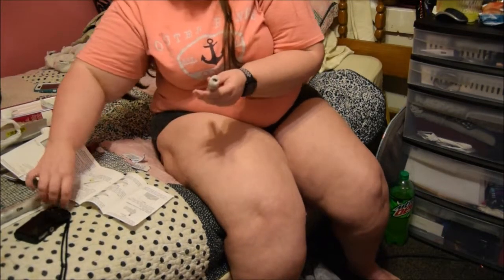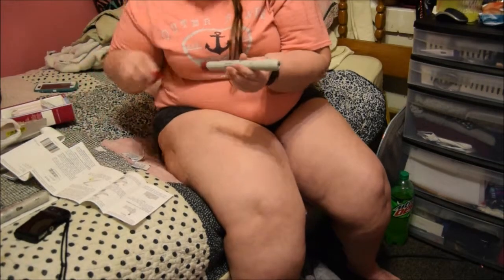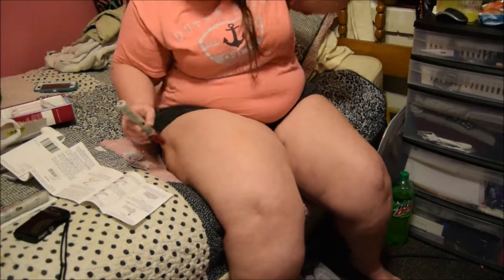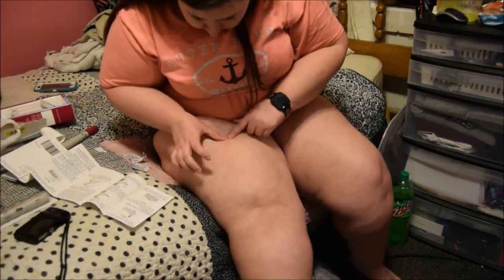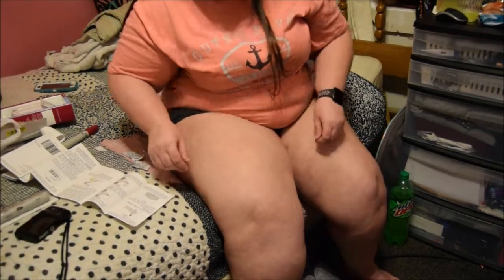So now I'm going to put the cap back on this one, and the cap back on this one, and then I'm going to dispose of this. So there's one. It's actually bleeding just a little bit. As you can see on here, maybe you can see it. But we're going to turn you closer and I'm going to show you the full section. So let's see if I can do this. I want you to see my face when you do these.